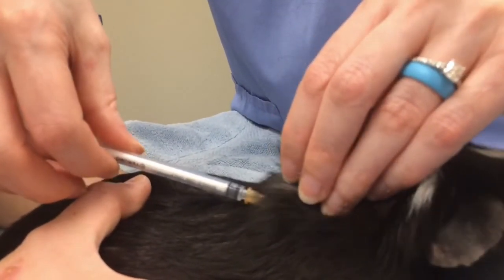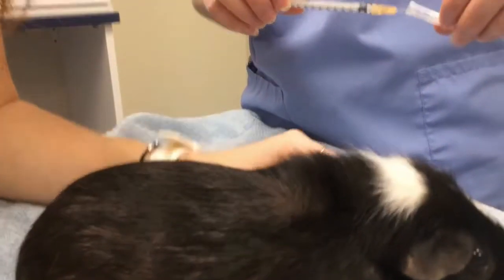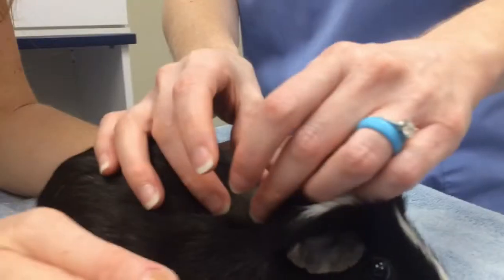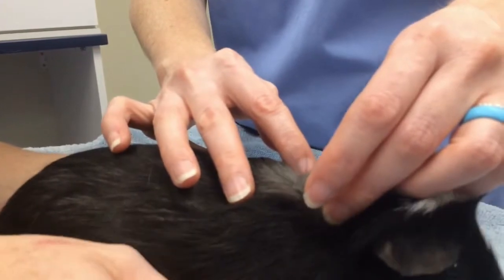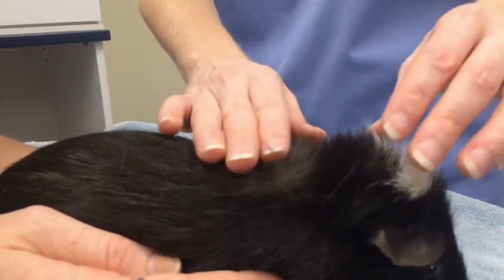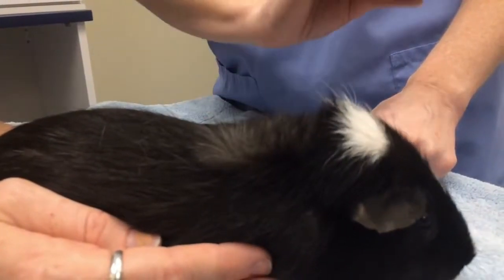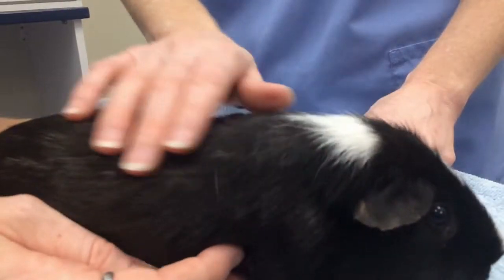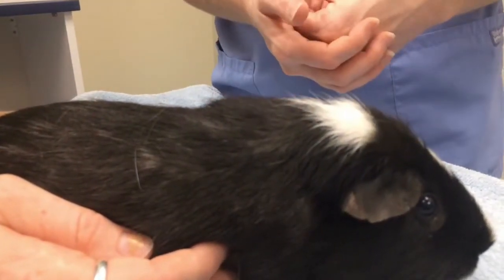He did great. We're just going to pull the needle out and gently recap it. Make sure there's no leaking of the medication in the area where you gave it. If there is any leaking, you can take a little bit of a Kleenex or paper towel and wipe that down to make sure none of the medication is on the fur where he might be able to lick it off or ingest it.